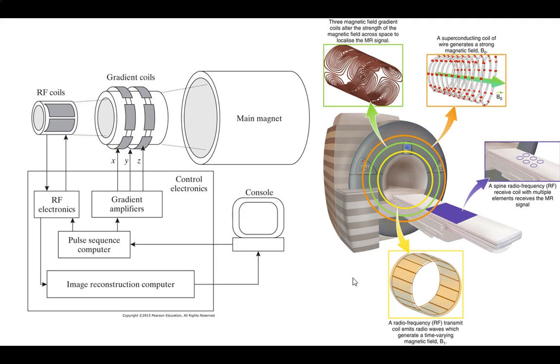And yeah, I do suggest reading the book. I'm not going through as many of the equations in here, but I'm also going through some stuff the book doesn't. So I'm going to try to mention differences between how you set up the transmit and receive, whether you do it on one coil, multiple coils, things of that sort.